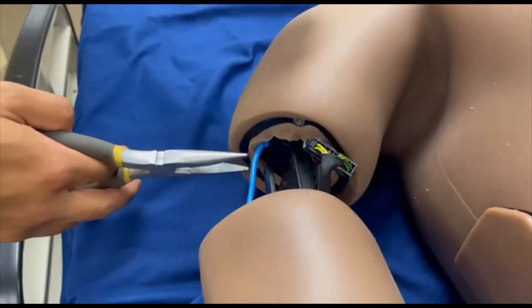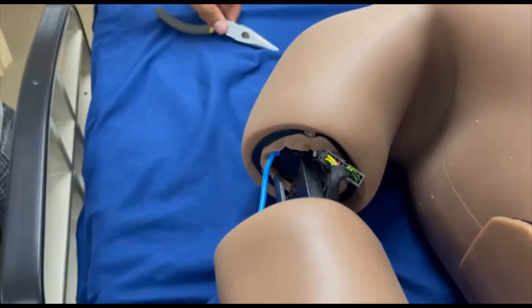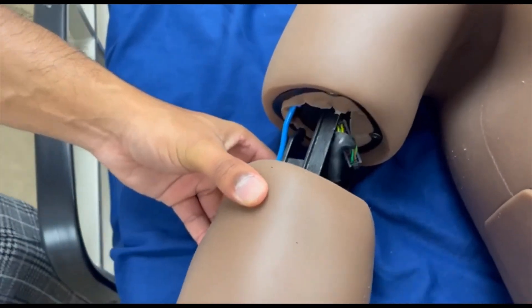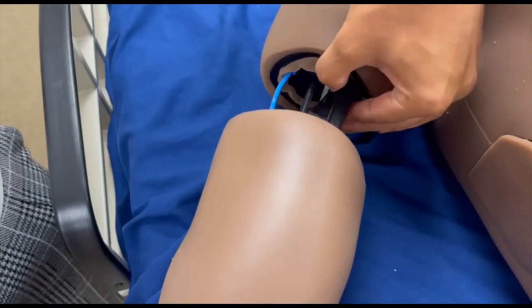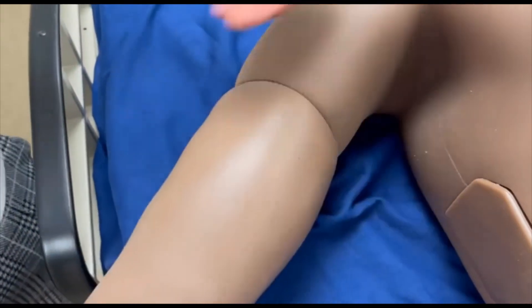If it's not properly seated, you will lose pulses throughout the whole entire system. Once everything is connected, put the cluster of wires into the groove and slide the arm into the slot. And then it's locked into place.